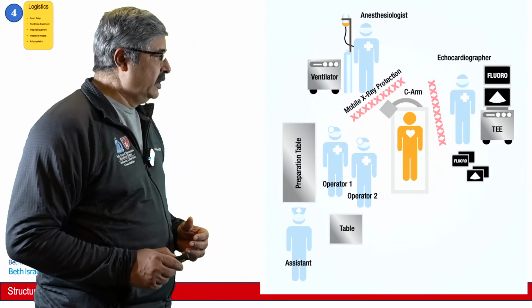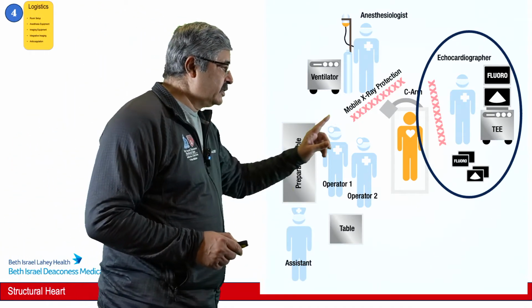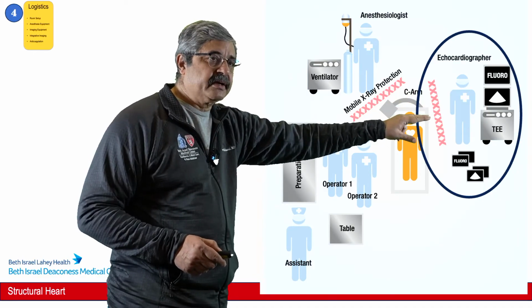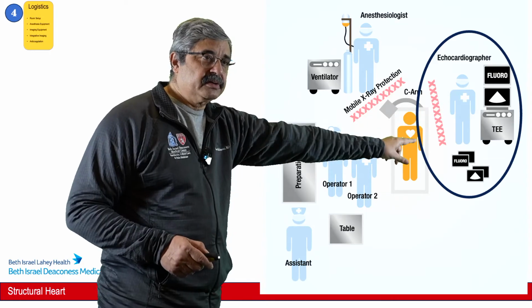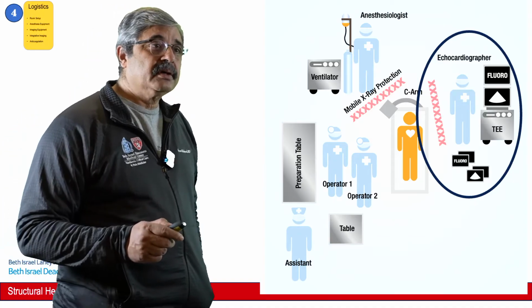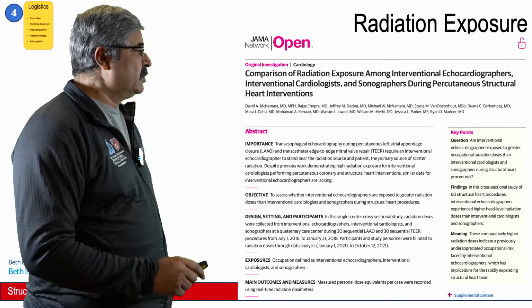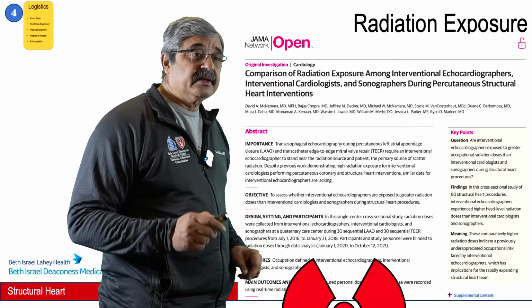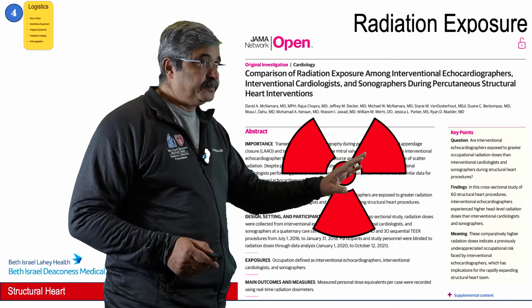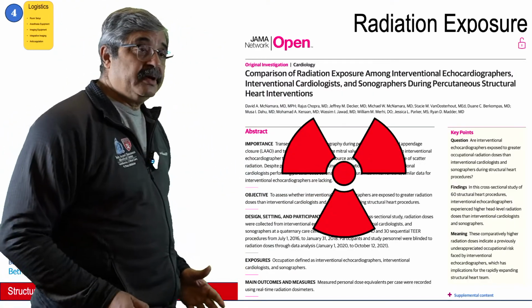Now this is an important diagram, and keep an eye on this one. You look at the anesthesiologist. I would look at the position of the echocardiographer in relation to the C-arm and the mobile equipment. This is a critical piece which is just being recently recognized, the proximity of the echocardiographer to the X-ray systems, because it has a lot of health hazards associated with it. There's a bunch of articles on this, but this is one of the most recent ones, which goes over the fact that the radiation exposure to the echocardiographers is multiple folds as compared to the interventionalists. And they're even better protected with these lead aprons under the table and everything, and we are not.